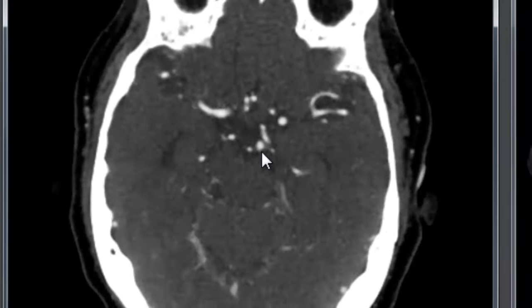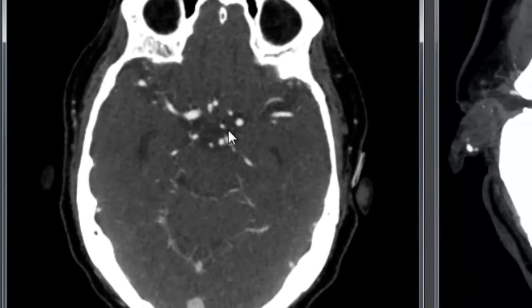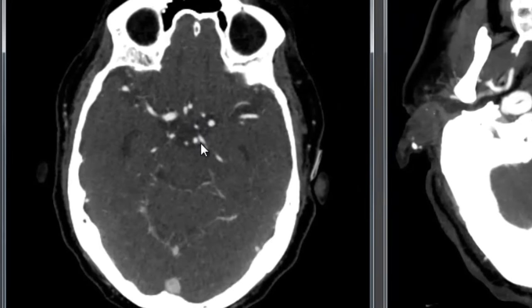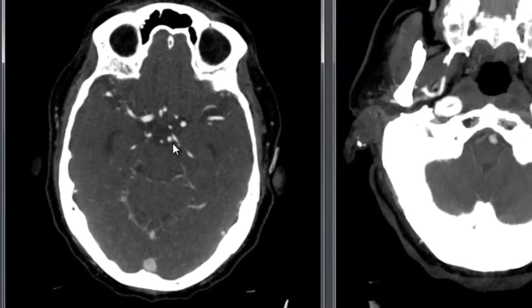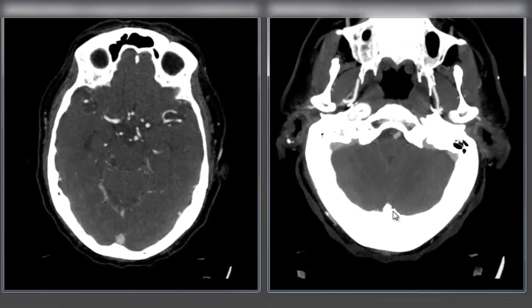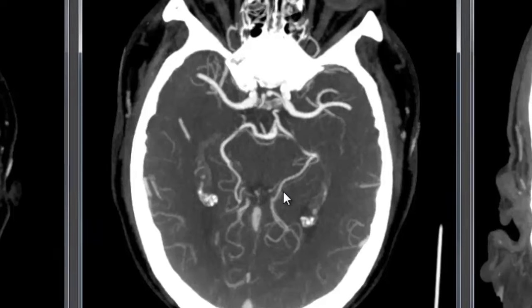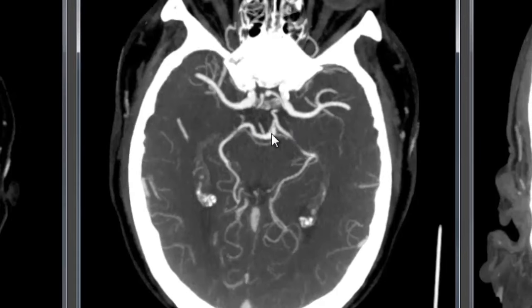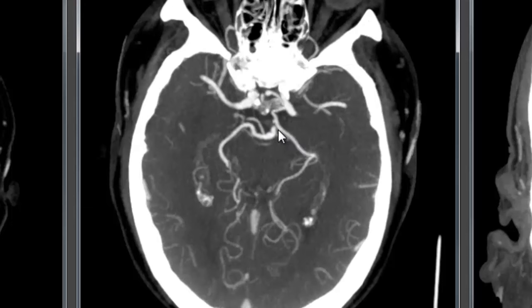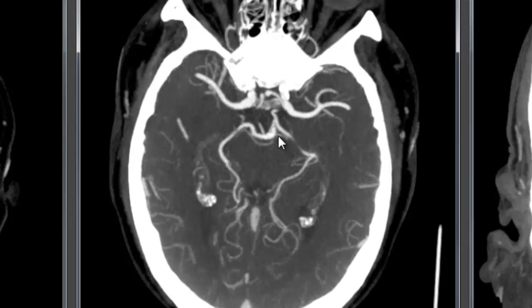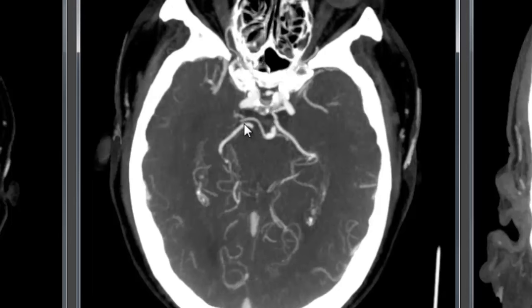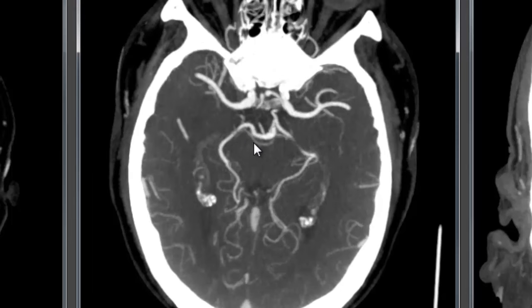Up at the top of the basilar we see some reconstitution by cross-filling from anterior to posterior by way of the posterior communicating artery, the PCoA. We can see this even better in our thick MIP reconstructions. At the circle of Willis level, we see opacification of the top of the basilar, and opacification of the posterior cerebral arteries on both sides. There's a largely fetal pattern PCA here with some connection at the top of the basilar and a smaller connection to the anterior circulation on the right side.